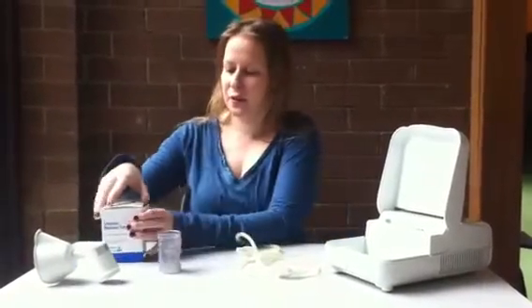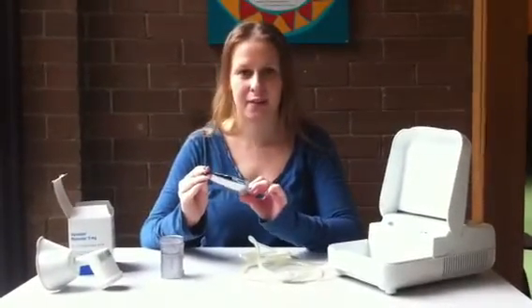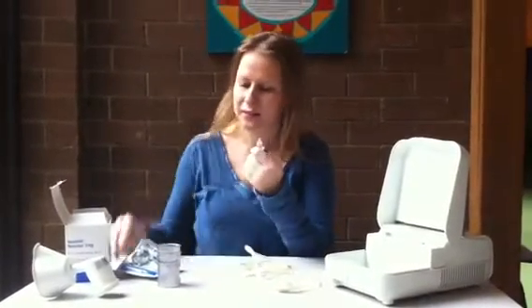The first step is to put the Ventolin into the nebulizing chamber. Take out your medicine and check the expiry date — it's September 2011. Take out one of the ampules and pour it directly into the chamber.